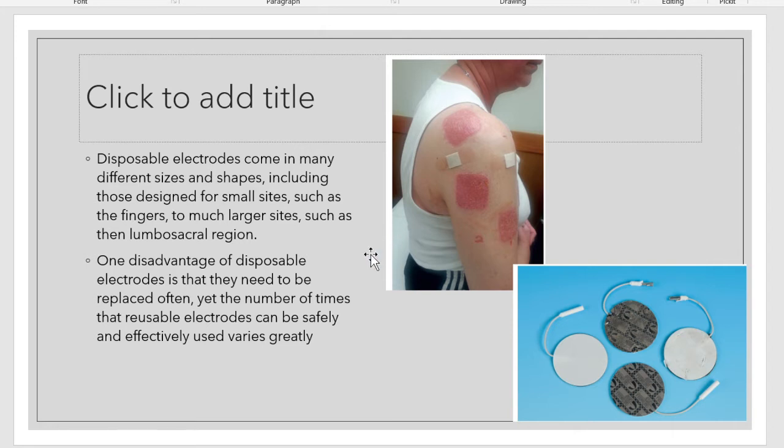So bantayanan, no? So okay ra kung ang imong patient, ang iyang complaint lang is na siya pruritus or itchiness, mga ato lang siya. So if you have this kind of reaction, so that is a different story. So you have to stop using this kind of electrode. So you use the rubber one, then put gel on it. Then of course instead of using, you should use tape, no, para maka-hold.